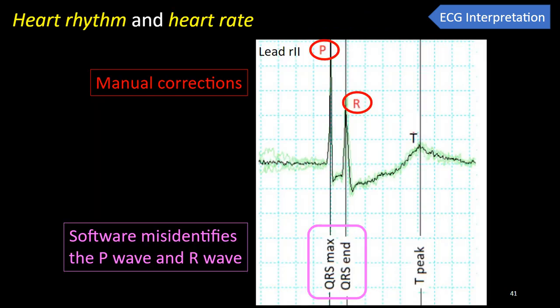Now, for heart rhythm, we determine the heart rhythm to be sinus if there is a P wave preceding every QRS by a normal and reasonably short PR interval. We determine rhythm regularity by the regularities of successive PP and RR intervals. Zebrafish P wave can be quite large, even larger than the R wave at times, as shown in this figure. So it's important to verify that the software identifies P wave and R wave correctly, and we can fix any auto-identification errors by moving the misplaced cursors to the appropriate waves.